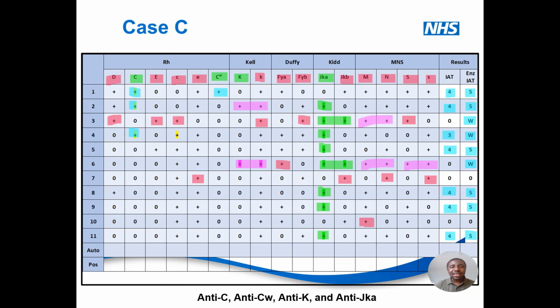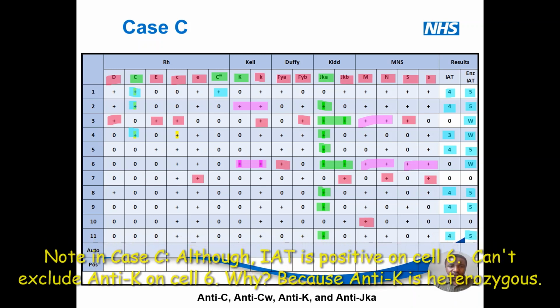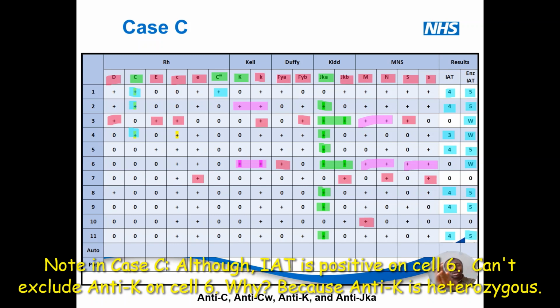So now, look at the same example here, but in a different way. I've made this one a little bit more complicated, for a reason, okay? Because I had already taught you this, I'm not going to repeat myself over and over again. Anywhere that I mark red, I've cancelled the antibody. So you study from what I've shown you, okay? Anywhere that I mark purple, like the way I've stretched this purple, I'm saying they are heterozygous here, and maybe with green, I'm saying they are heterozygous here.